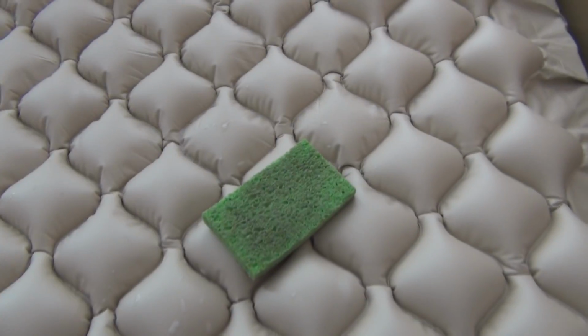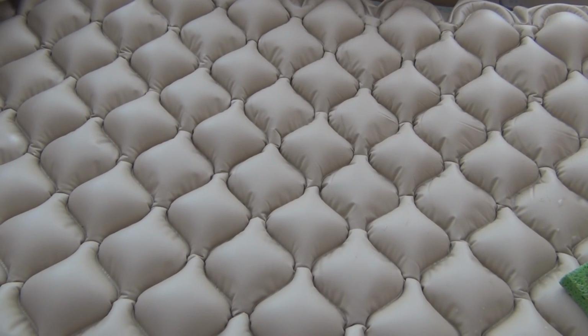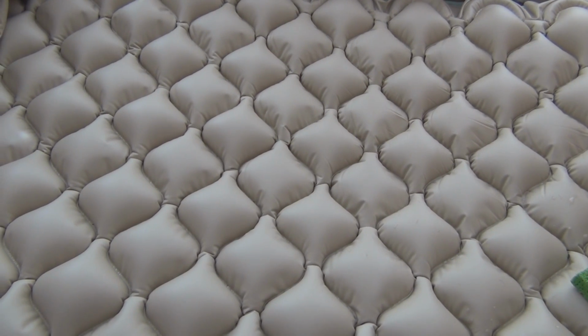So, when the medical supply guy came over, he said, gee, this should have been a repair. As soon as he said that, it sort of jogged my memory, but like most people, I probably took this repair kit and said, oh, I'll put it here where I won't forget where it is, and of course don't remember where it is. But I'm thinking that this was a specialized piece of equipment, and really nowadays if you do a search on the internet, you can find this equipment. You don't need to go to the medical supply place. And like I said, I'm trying to be proactive here.